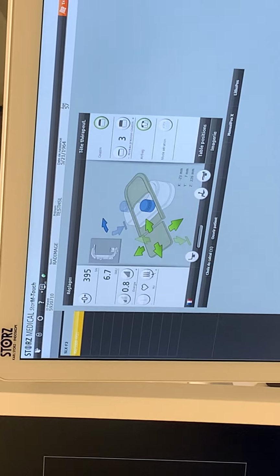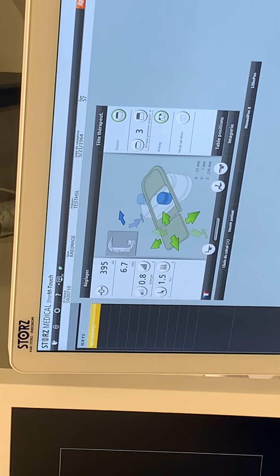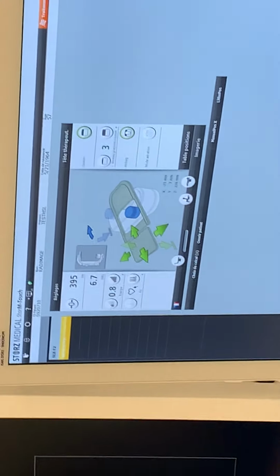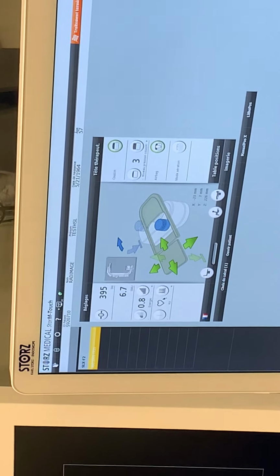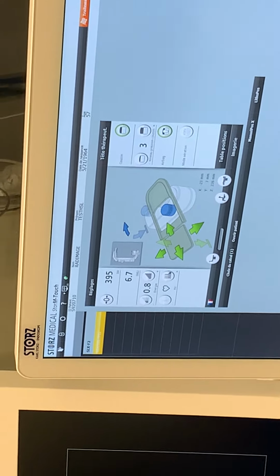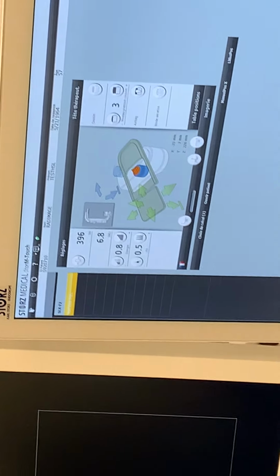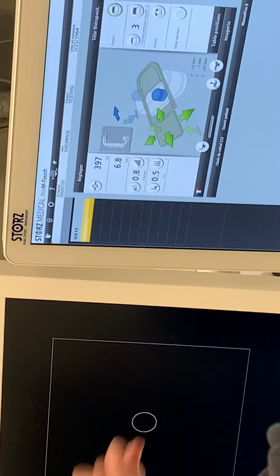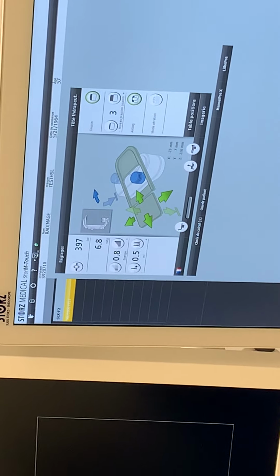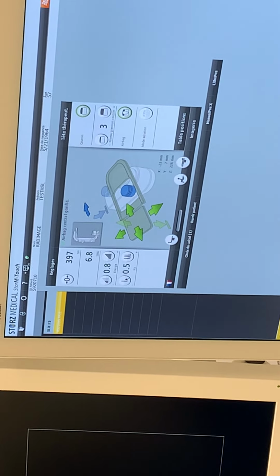You only lower the frequency. Normally we are at 1.5. And then restart. You look at your heart and that's it. But this is not possible while you are releasing shockwave, so you really need to stop the shockwave. If you're releasing shockwave, it is not possible to go lower. So 0.5 is 30, 1 is 60, 1.5 is 90, and 2 is like 120.